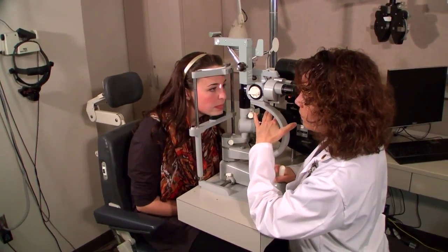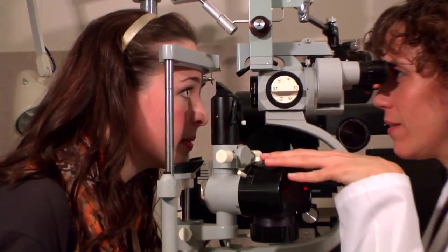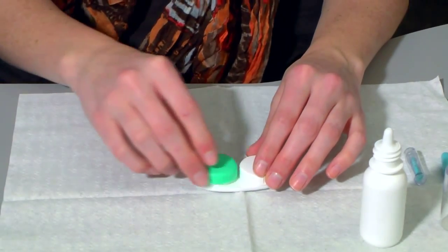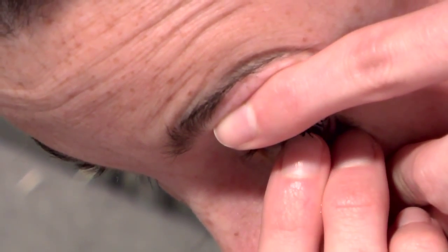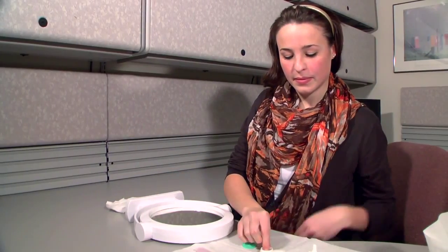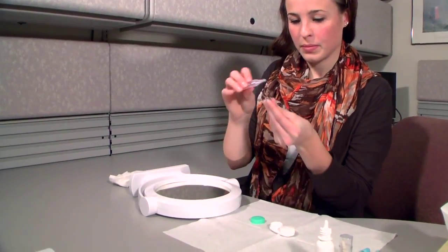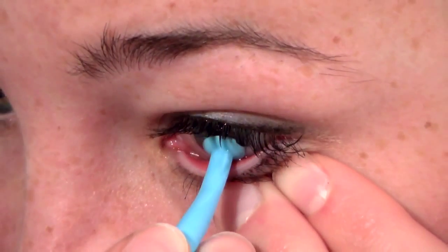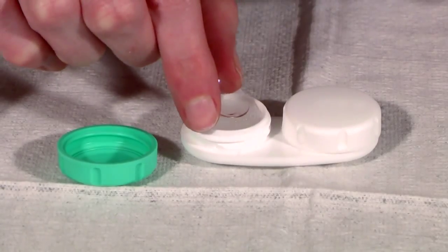Your contact lens professional has determined the best wearing schedule for you and your eyes, and has prescribed a specific material designed for your needs. Follow the wearing schedule outlined by your contact lens professional and never wear your contact lenses longer than recommended. While scleral contact lens wear is extremely safe, sometimes a problem can occur. If you notice a change in your vision, remove your contact lenses and call your contact lens professional's office immediately — they'll guide you on your next steps.